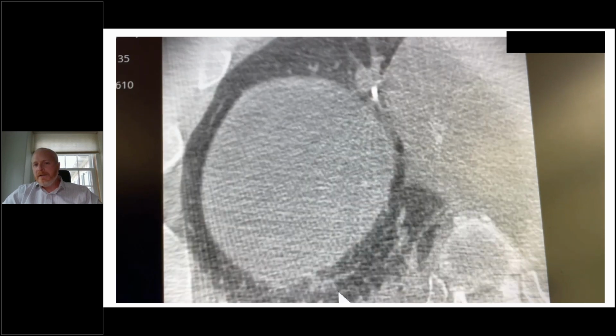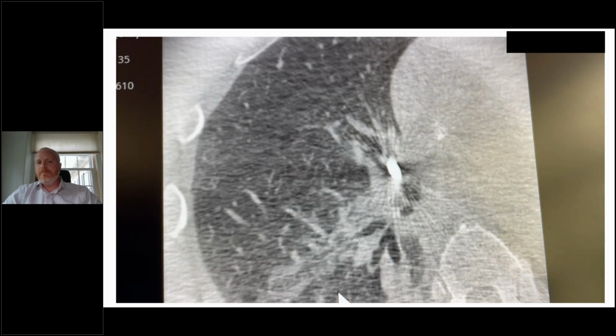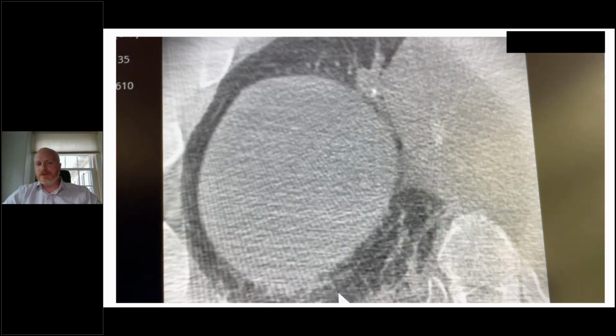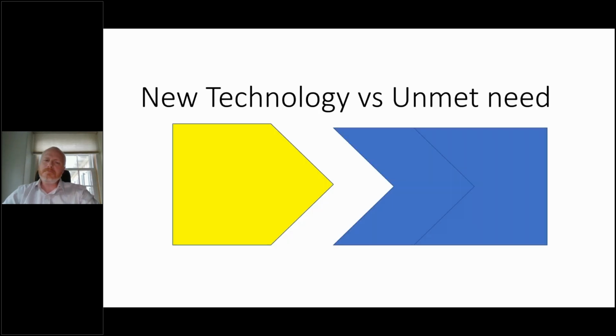So you see, I moved the needle into position and the forceps into position, imaged before biopsying to ensure that I wasn't holding a piece of the pericardium or in danger of causing a liver laceration. But is there a better way that we can not just target lesions, but also sample them?